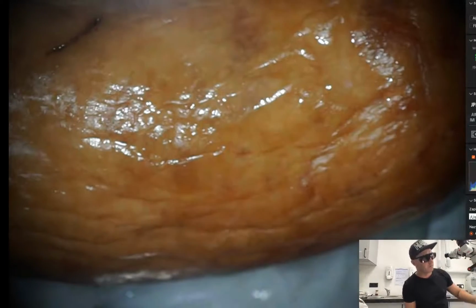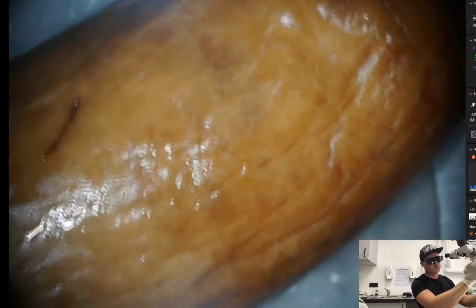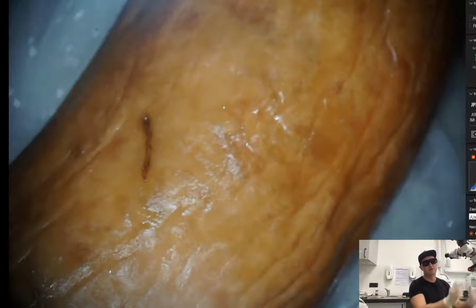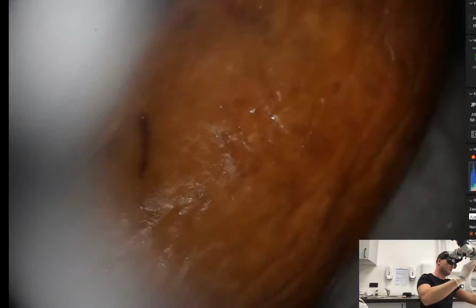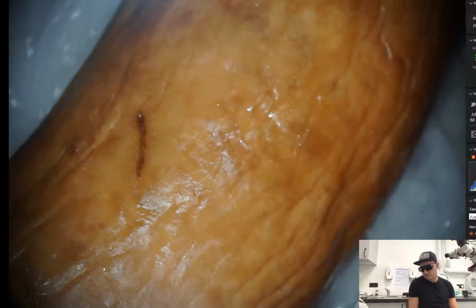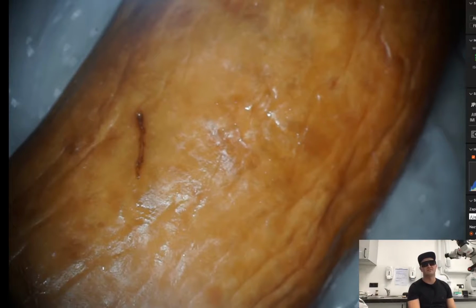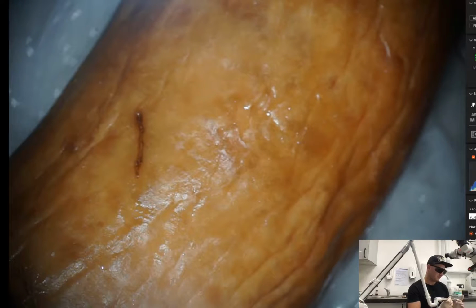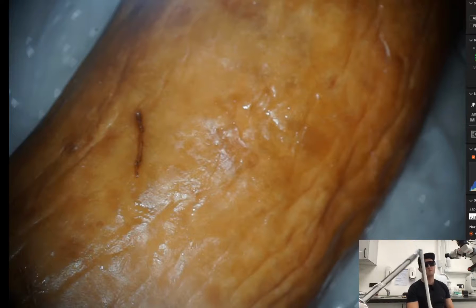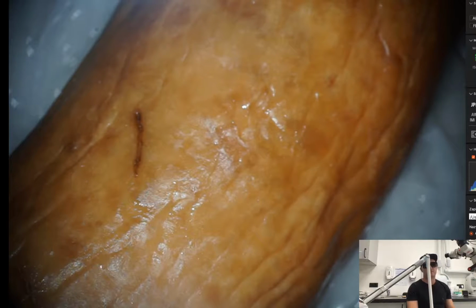And now we are going to focus on soft tissues, because as I told you in the previous episode, we are able to work with soft tissues, but there is a different physical basis of this work, because the erbium YAG laser does not absorb in pigments, but it absorbs in water. But still there is water inside the tissue, in all areas of the tissues.